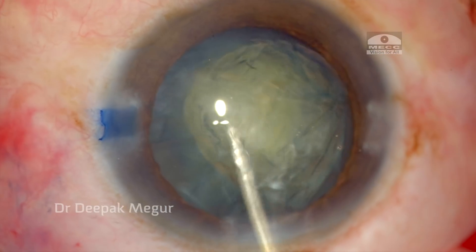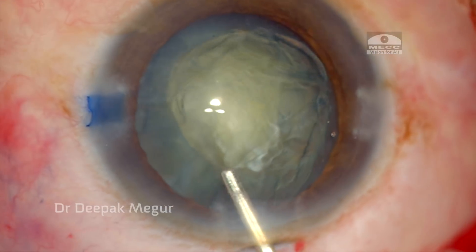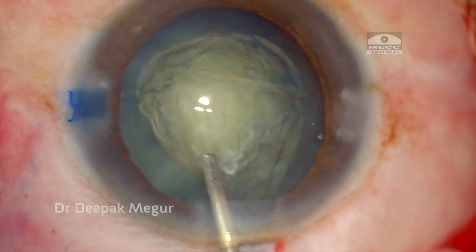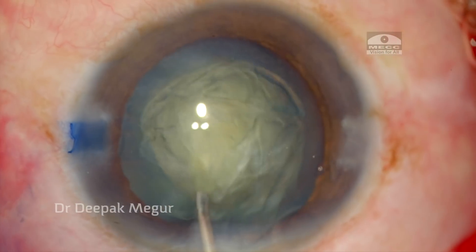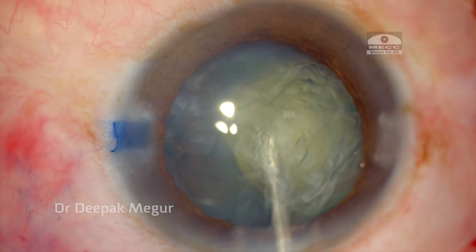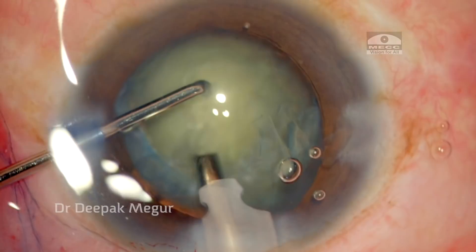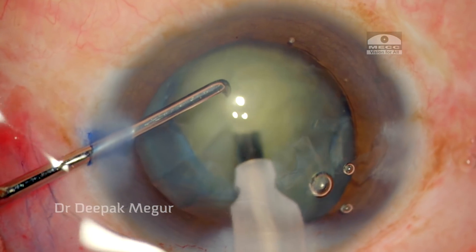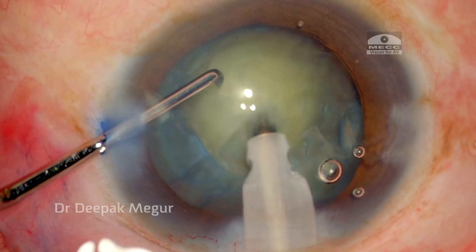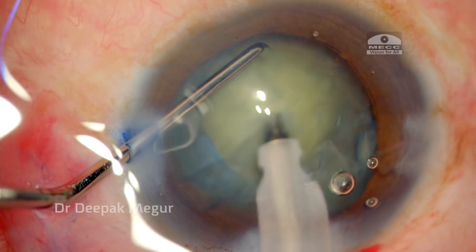Having placed the ring, I go back to hydrodissection — I want to repeat it again just to ensure that the cortical adhesions are totally broken. After the hydro procedures, I move on to emulsification of the nucleus.